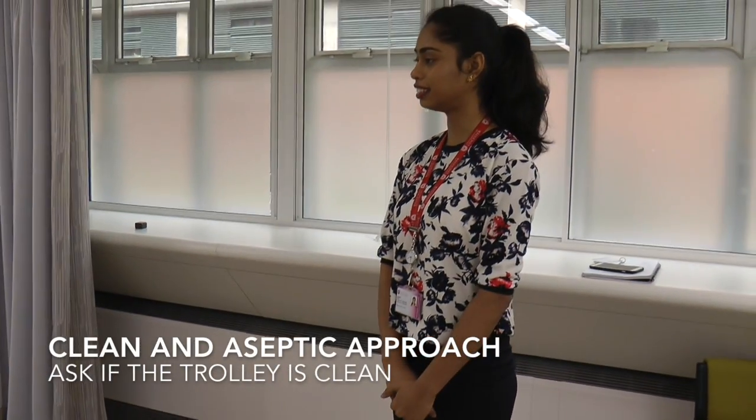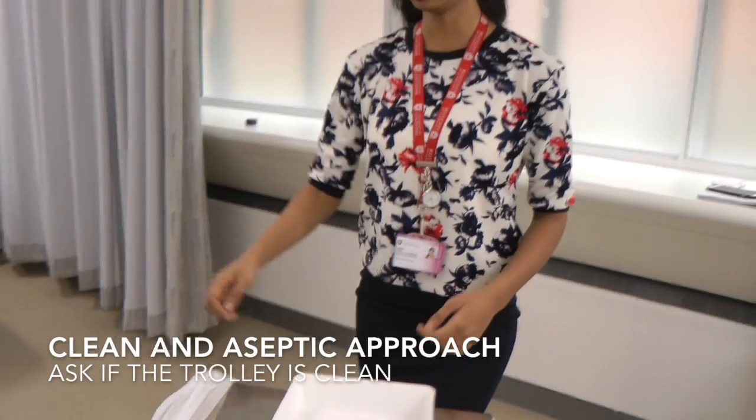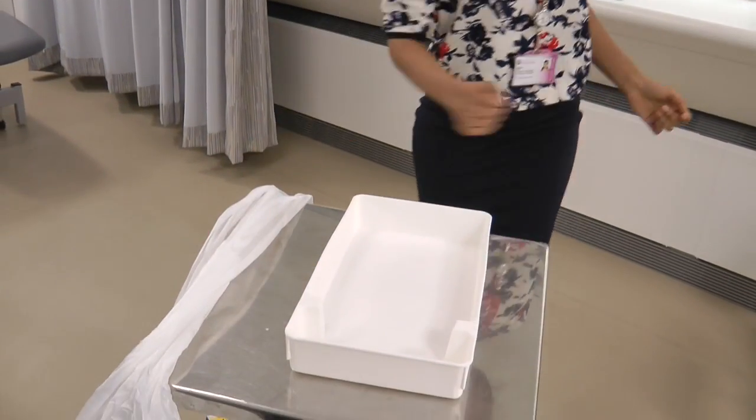Have the tray and trolley been cleaned? Yes, those are clean. Thank you very much. So I'm going to start by washing my hands.